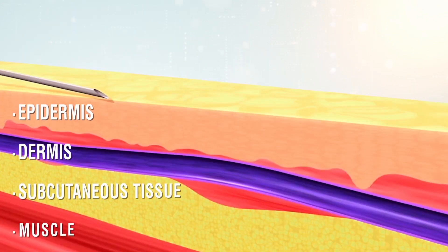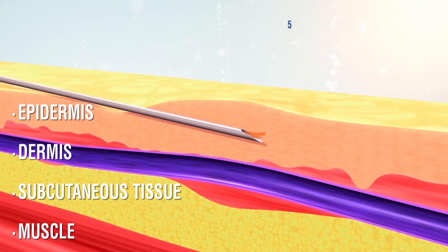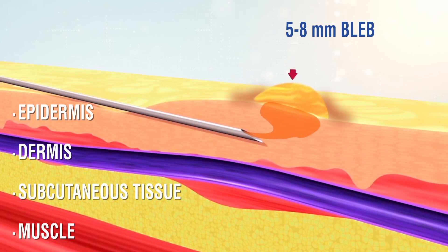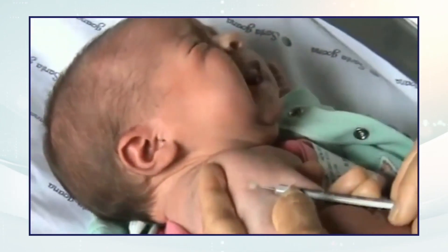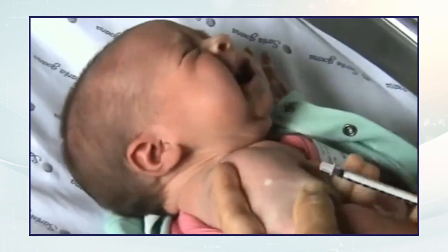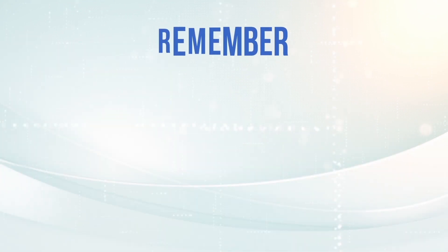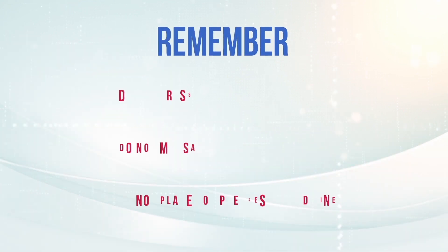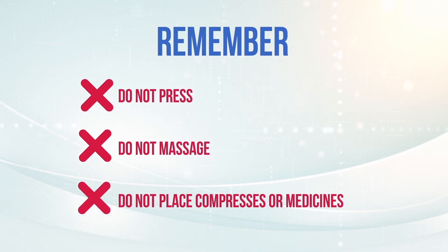Stop stretching the skin and slowly inject the vaccine. When administering the vaccine correctly, a small bleb of 5 to 8 mm will be formed immediately. When finished, remove the needle gently. Gently stretch the skin to prevent the liquid from coming out. Remember, do not press, do not massage, and do not put compresses or medicine on the injection site.